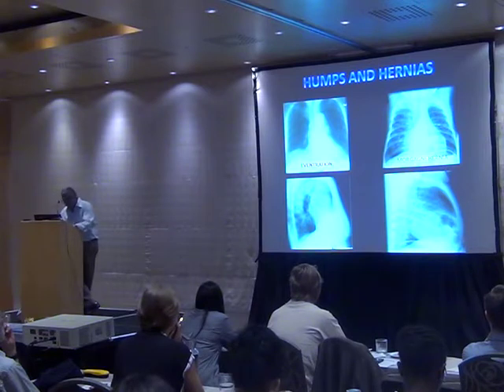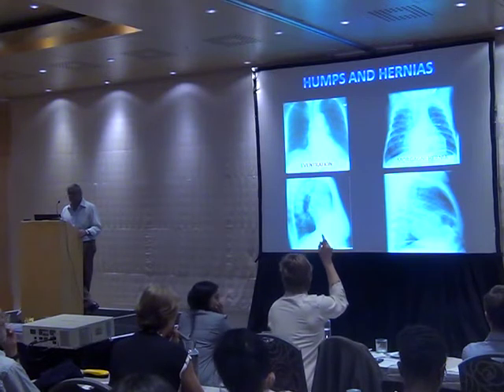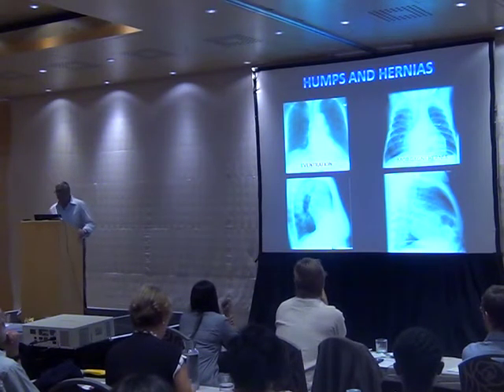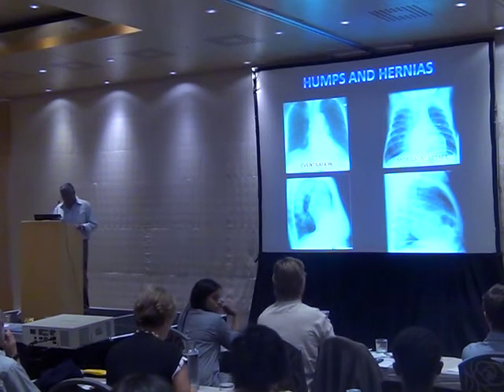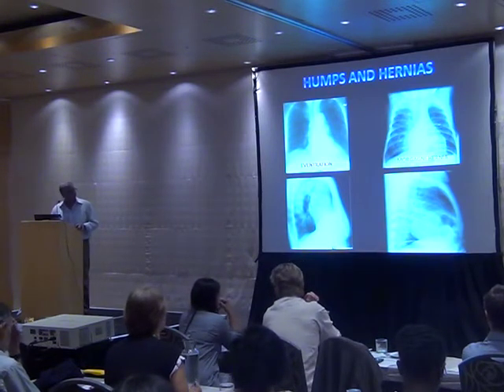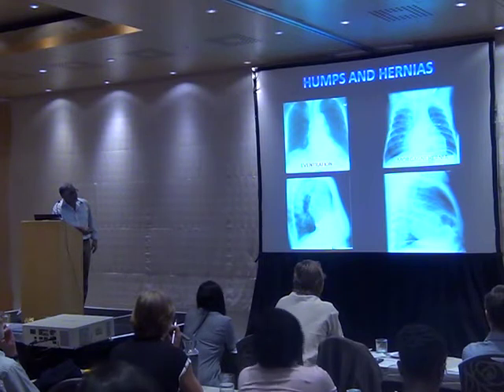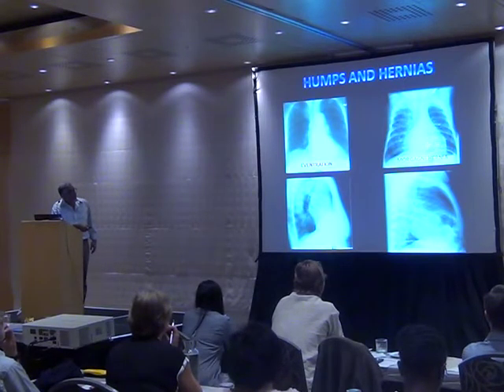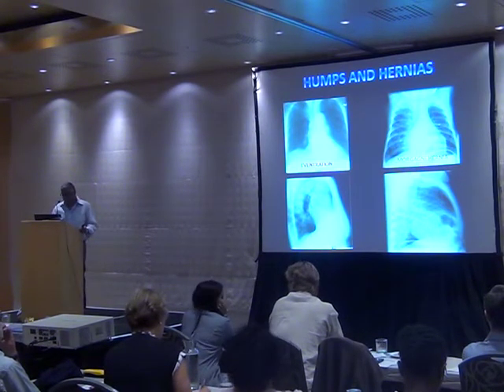On the lateral projection, the eventration is seen anteriorly, and we can confirm it is on the right side. We can see a right-sided hump that is continuous with no bowel running into the chest, whereas in a Morgagni hernia there are loops of bowel or cystic lucencies behind the heart visible on the lateral projection.